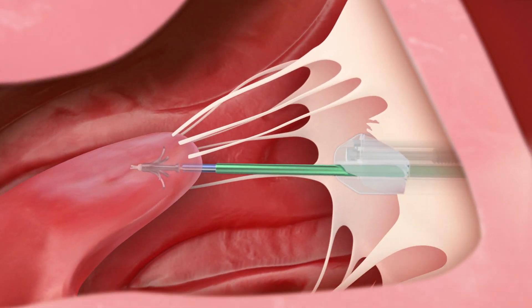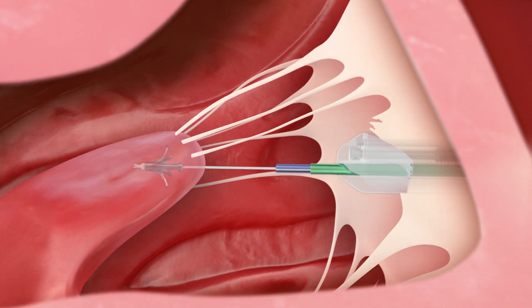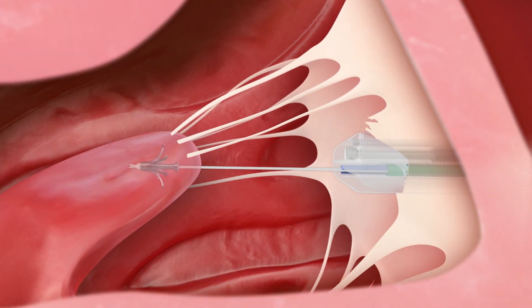The sleeve and the implant holder are retracted further, dispensing the suture. When the proximal anchor reaches the atrial surface of the leaflet, it is released.